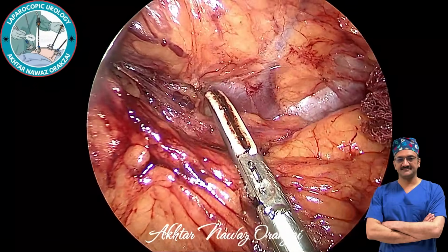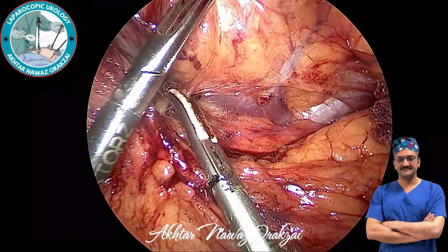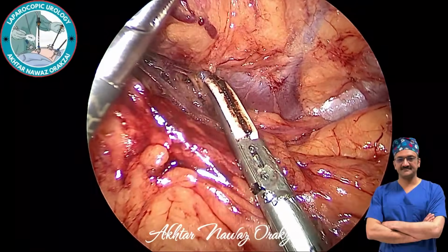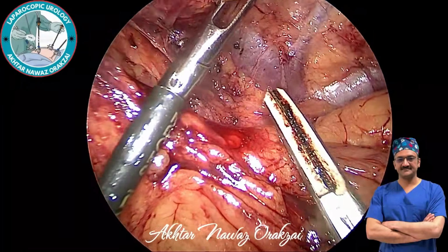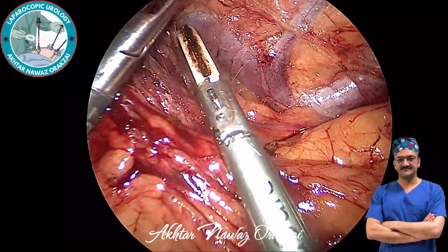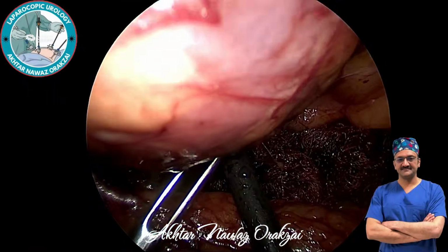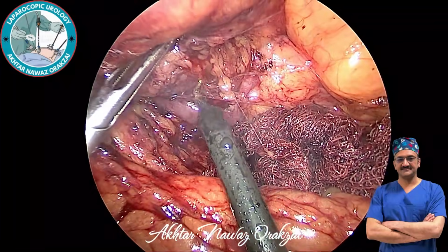Instead it is a lower polar vein. So the decision has to be made about whether to clip the confluence of these two veins, which is draining into the renal vein, or we can dissect this small vein away from the adrenal vein.